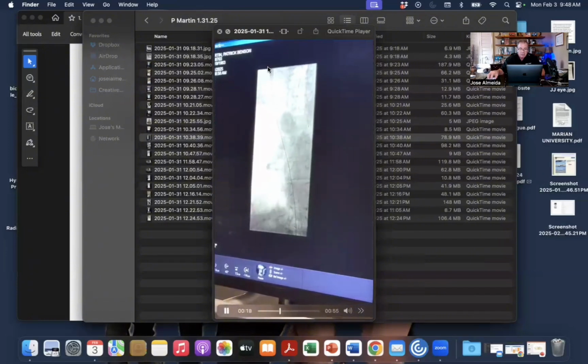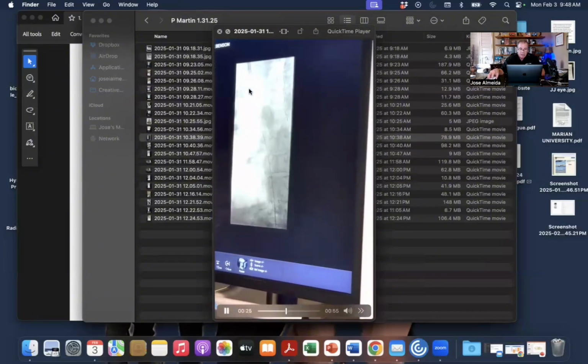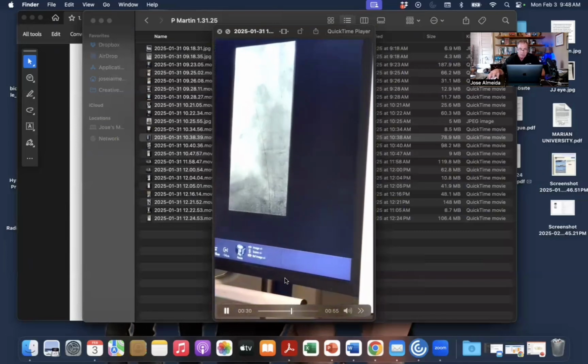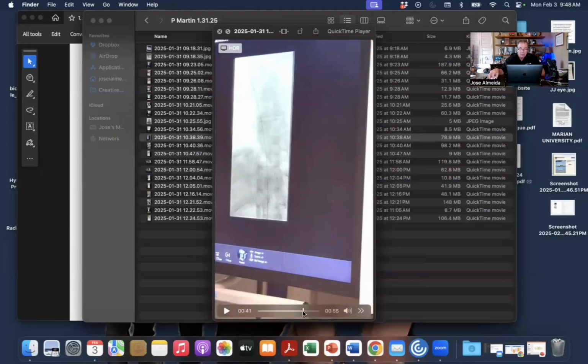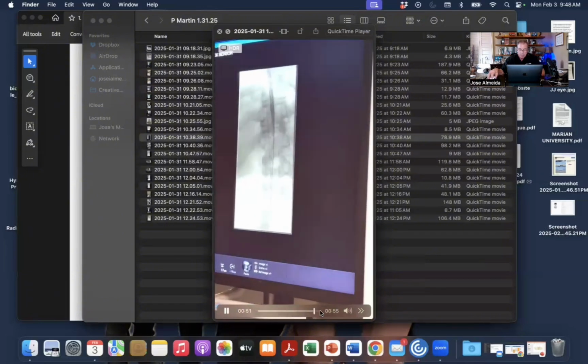So here you see under fluoro the big sheath coming down, again with a strange angle, a little more lateral than we like, but we knew we were in the inferior vena cava. We confirmed it with IVUS and venography. Very important. You don't want to put that big thing in the carotid artery. And believe me, people have done it.